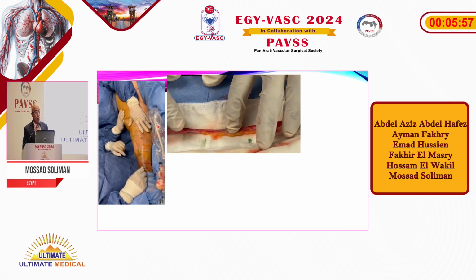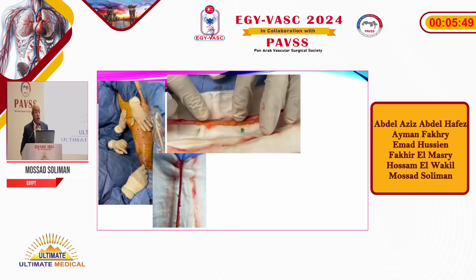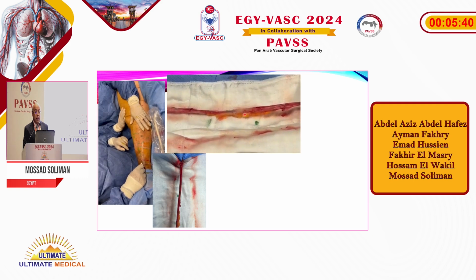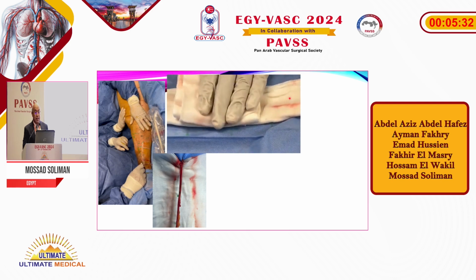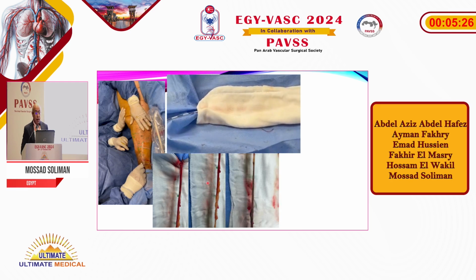So at the sites of the phlebectasia, we don't do 1 cycle or 2 cycles, but 3 cycles, depending on an ex vivo study that has been done. We noticed that in an ex vivo saphenous vein, when we do a single session ablation, only the intima is affected; when we do a double session ablation, intima and media; and when we do a 3-session ablation, there is extension or even shrinkage of the vein, extending to the sides of the tributaries.